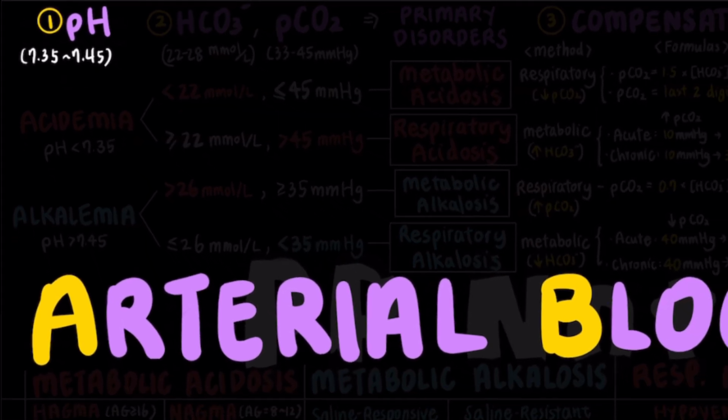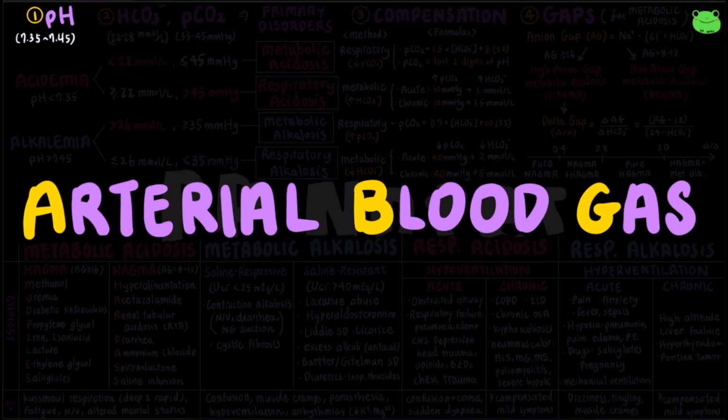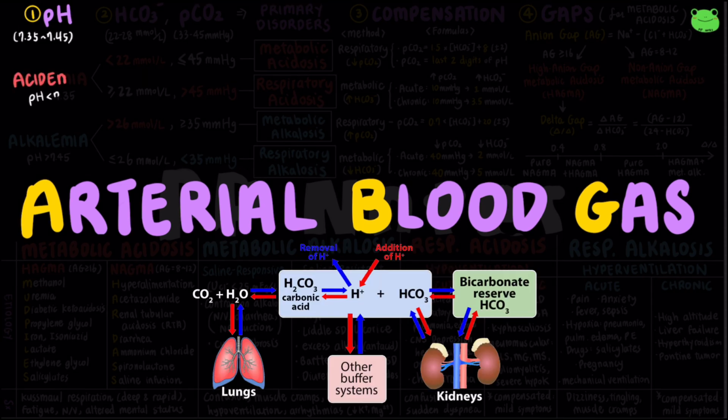Now let's dive into the step-by-step guide to ABG interpretation. First, look at the pH, which normally ranges from 7.35 to 7.45. A pH less than 7.35 means acidemia, while a pH greater than 7.45 means alkalemia. This gives us the overall direction of the disturbance.